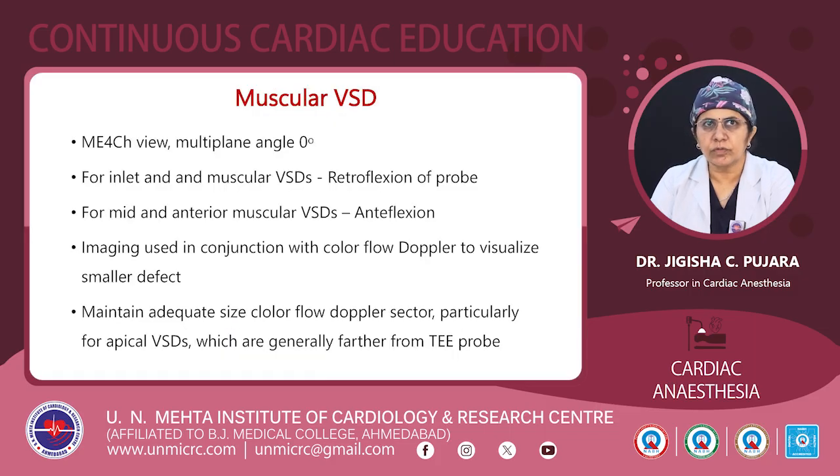Muscular VSD, mid-esophageal four-chamber view, multiplane angle again at 0 degrees for the inlet. For the muscular VSD, use retroflexion of the probe. For a mid and anterior muscular VSD, one should do anteflexion. Imaging is used in conjunction with color flow Doppler to visualize smaller defects.